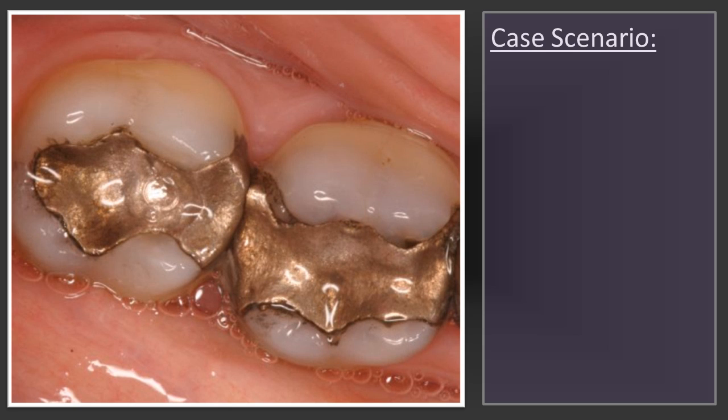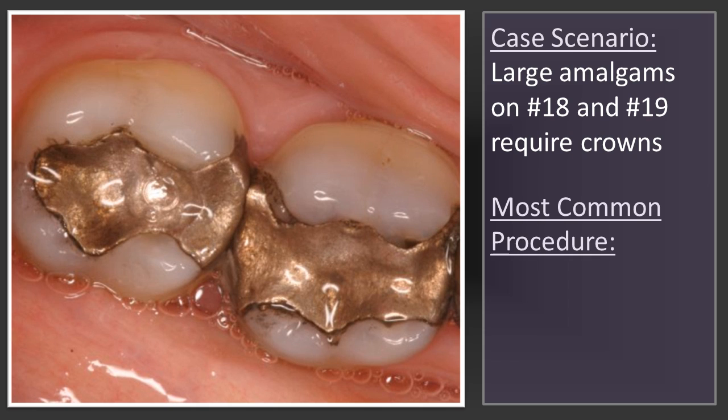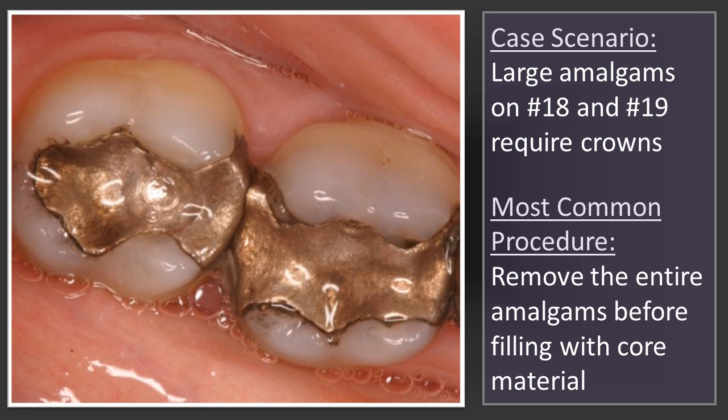This patient presented with two large amalgams on teeth 18 and 19 that required crowns. Normally if you're going to build these teeth up, the dentist would take the amalgams out, put matrix bands around them, and fill those teeth with their buildup material.